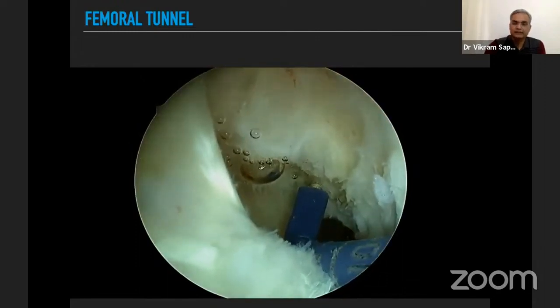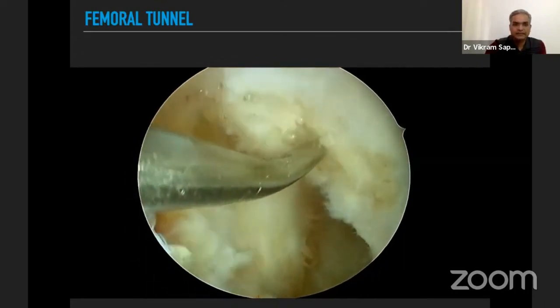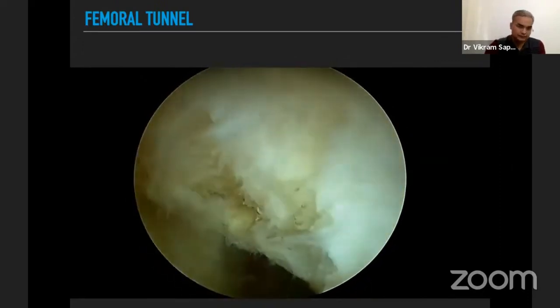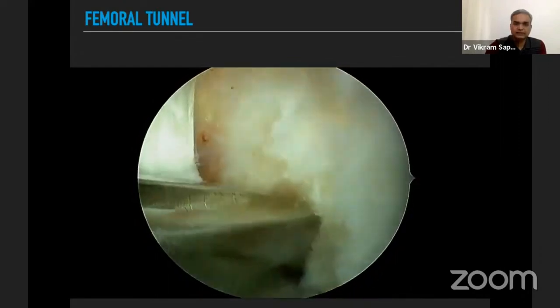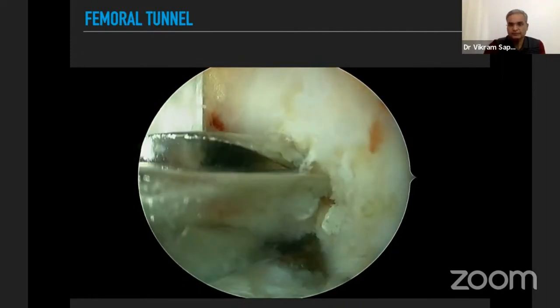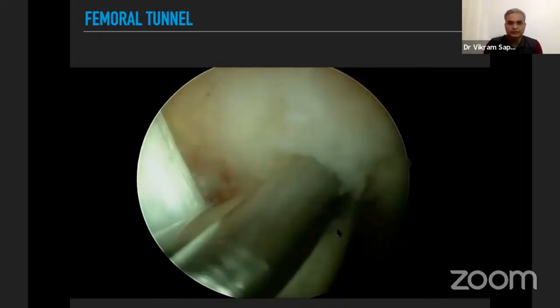The position can be marked with a cautery or a marking awl. I also use a femoral aimer to fine-tune the femoral tunnel position. A size 6 or 7 femoral aimer is commonly used. Once the guide wire is passed, I use a 4.5 mm reamer to begin drilling.